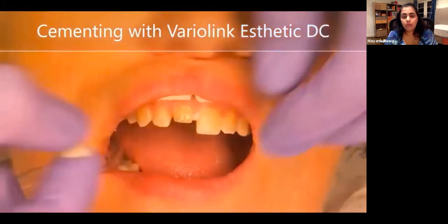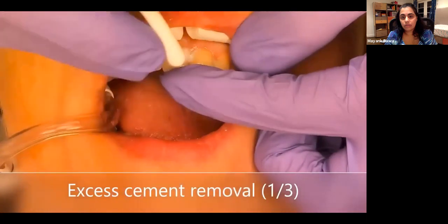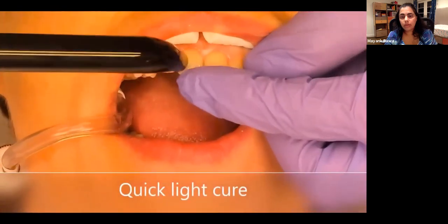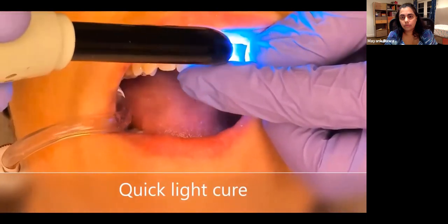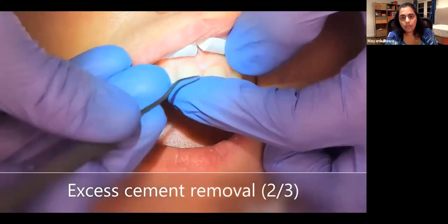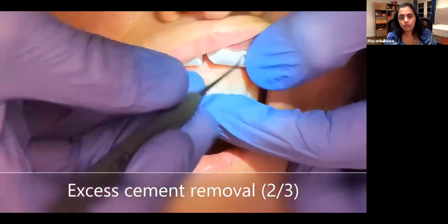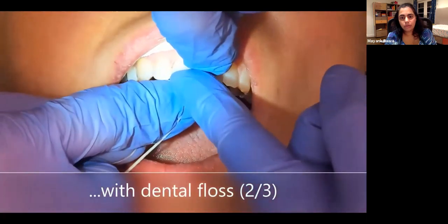Very important to take out all the excess cement before you start curing for more than 30 seconds. It's really hard to remove it after it's completely set. You do a quick light cure, and then you want to take out all the excess cement at this step. Using a scaler is pretty effective. Go right under the gingival margins.